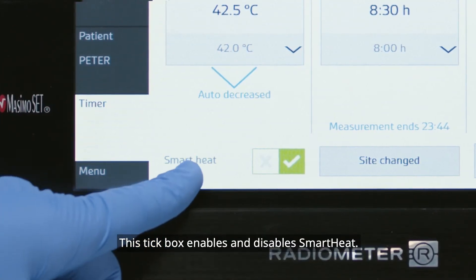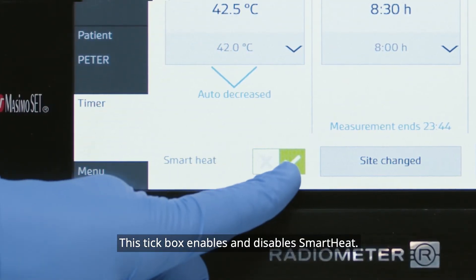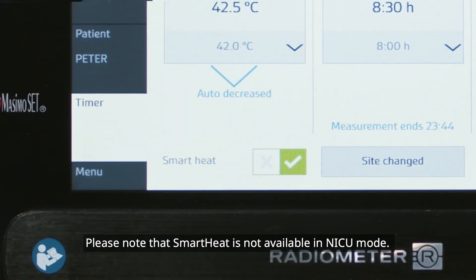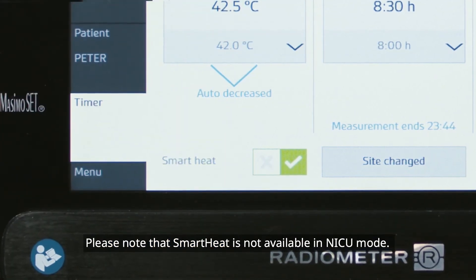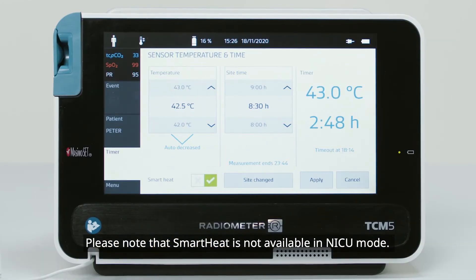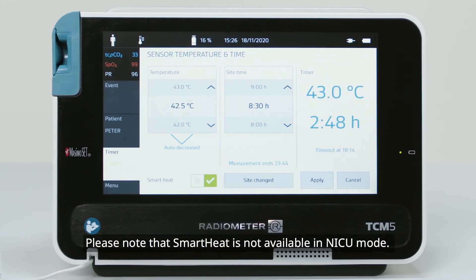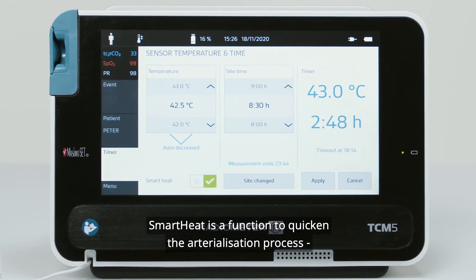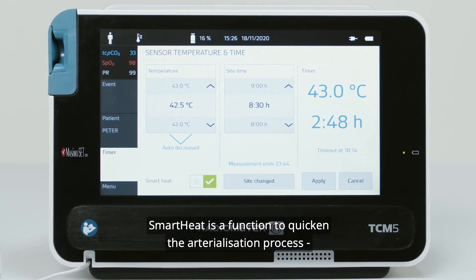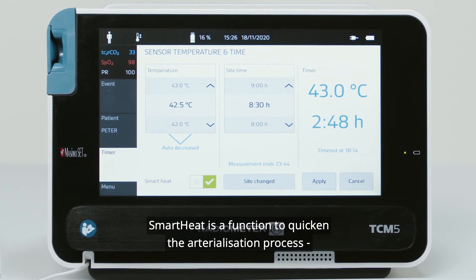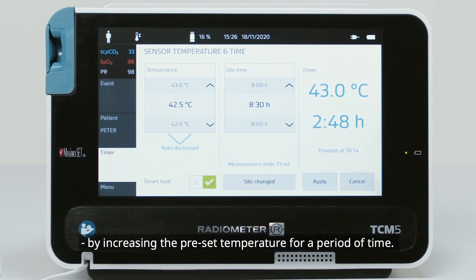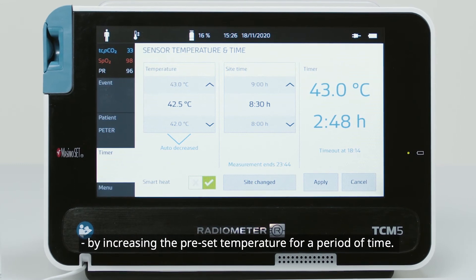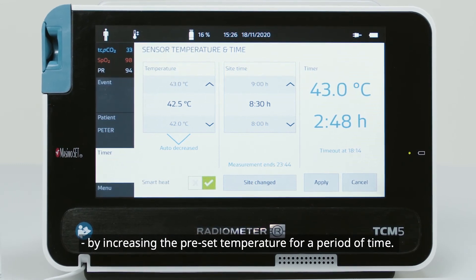This tick box enables and disables SmartHeat. Please note that SmartHeat is not available in NICU mode. SmartHeat is a function to quicken the arterialization process by increasing the preset temperature for a period of time.